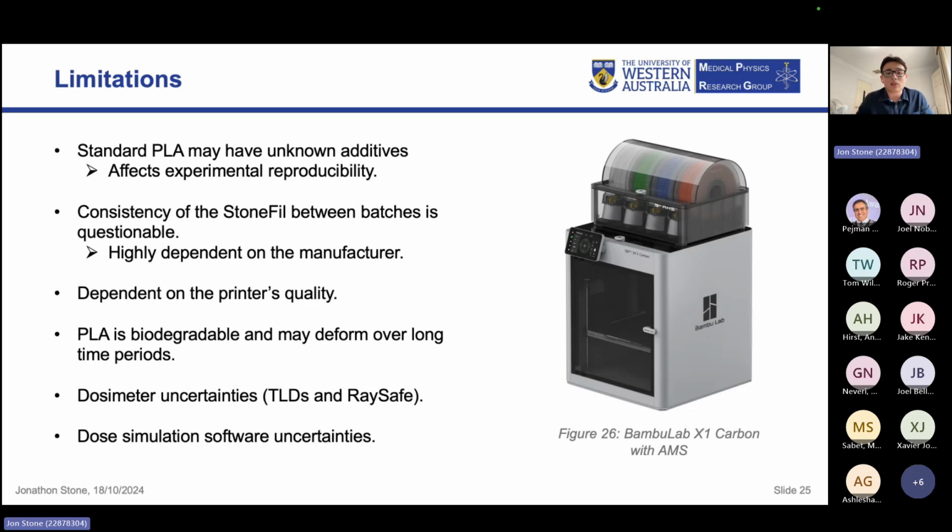Also, the consistency of the stone fill between batches is questionable. And this is also, again, highly dependent on the manufacturer, because Form Futura create their own stone fill PLA, which means that they might have added different amounts of stone powder between each batch.